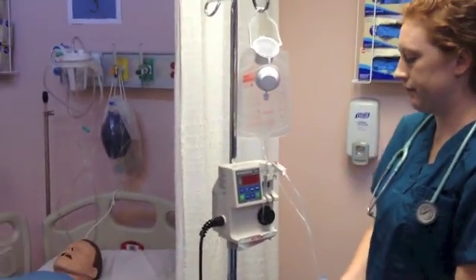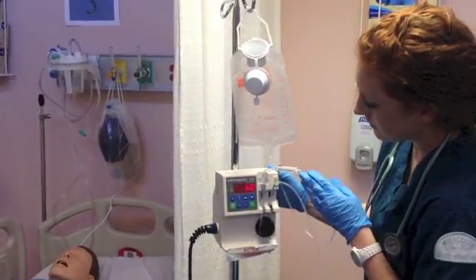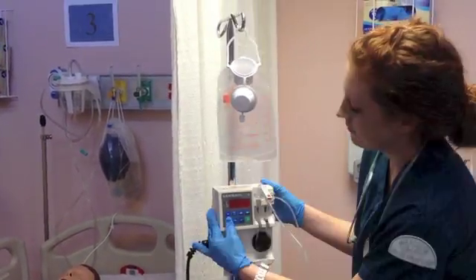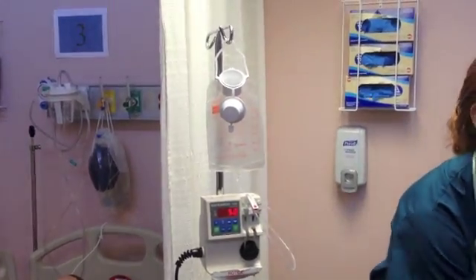Then we're going to turn on the pump and set our rate. In this case, it's going to be for 50 milliliters an hour. We can now just roll up that roller clamp. We can hit start. We also want to make sure that we date our bag for the time of the feeding.